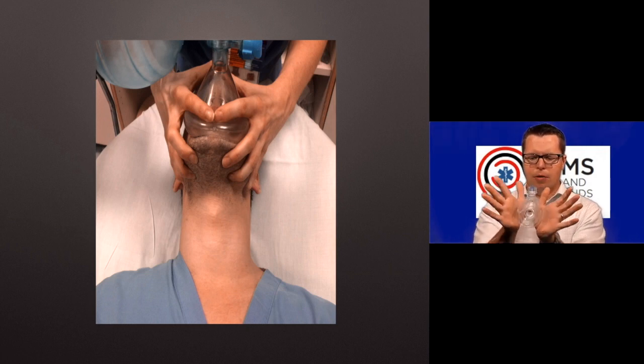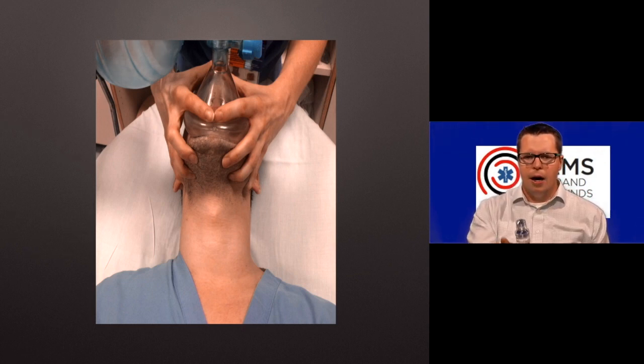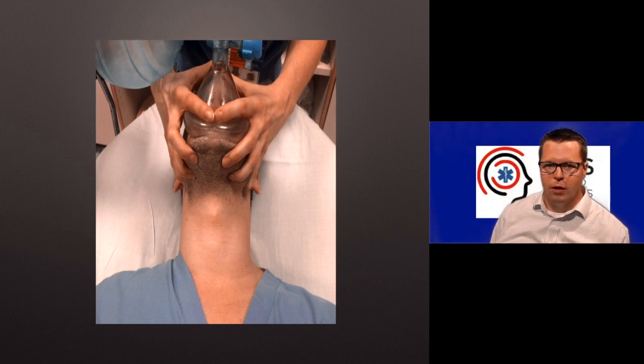I prefer myself the thenar eminences on it, and then I reach behind their jaw and lift forward, again lifting the face up into the mask. Either of those is fine as long as you're doing the jaw thrust with it.